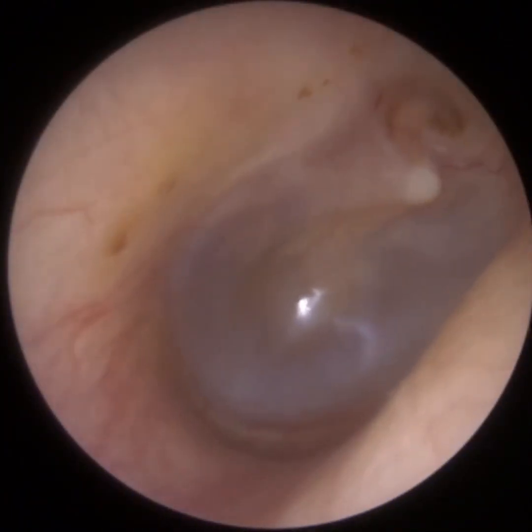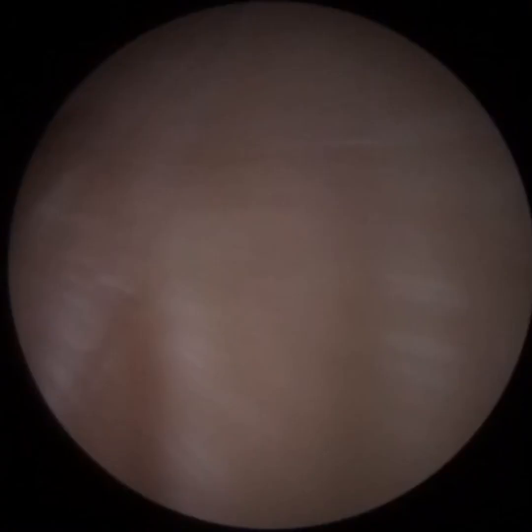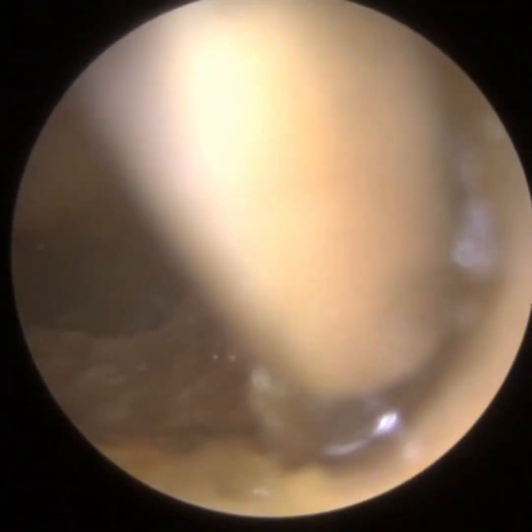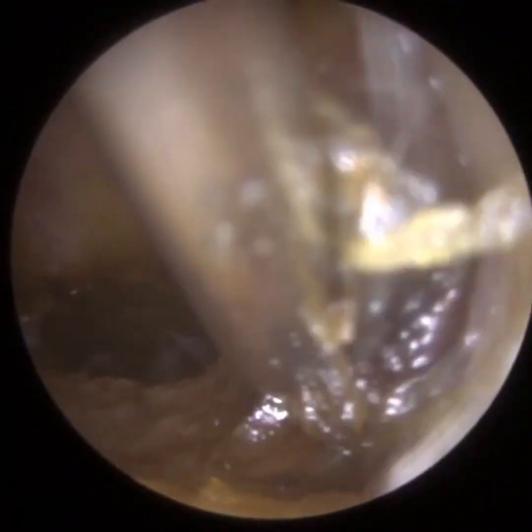So the right ear canal is healthy, but she has got an attic retraction. The eardrum is sucked in at the top due to a blocked eustachian tube. Now, we don't know at present whether this patient's also got a blocked eustachian tube in their left ear, because the ear canal itself has got a layer of dead skin, and you can see we're starting to peel this off quite laterally, and the majority of the eardrum is also obscured by this dead skin.